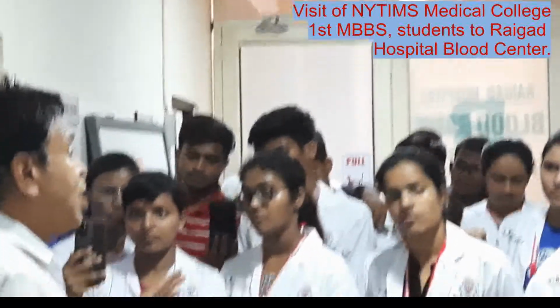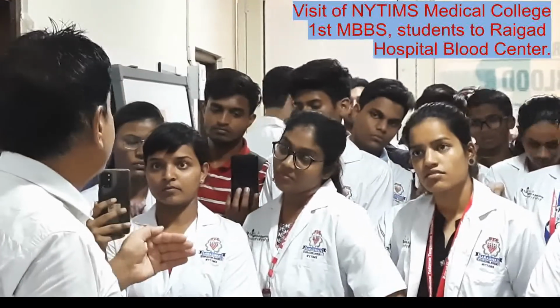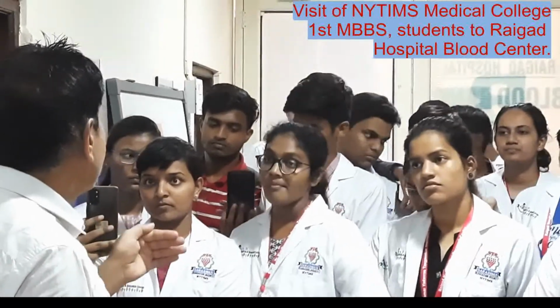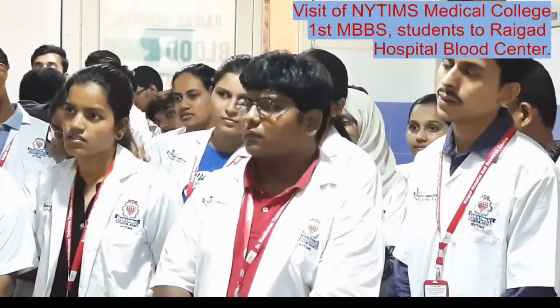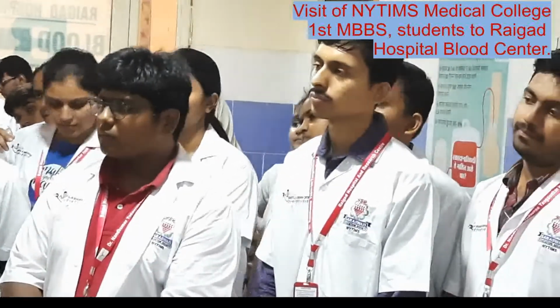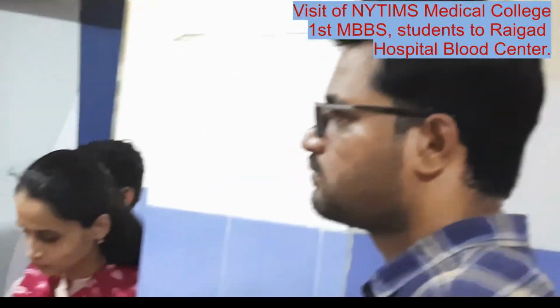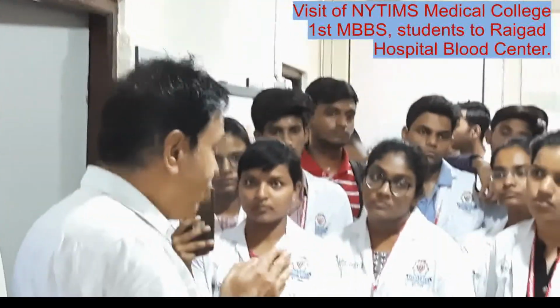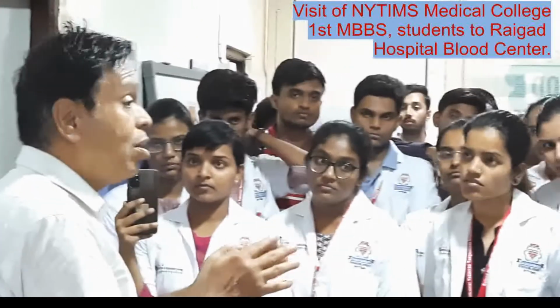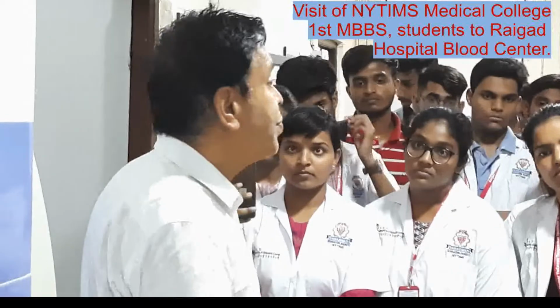So then we collect it and we separate it into components. From the blood there are various components that can be made. One is the packed RBC. Have you done blood group? Yes. So the red blood cells we separate, and it is known as packed RBC. We add anticoagulant into it and separate. Wherever RBC is less, we give packed RBC. Whatever is apart from RBC is the plasma. It contains coagulation factors and other factors, proteins.